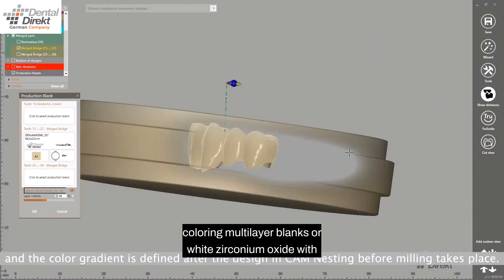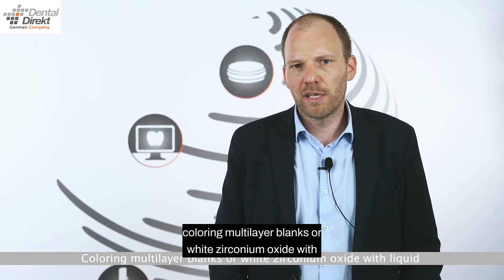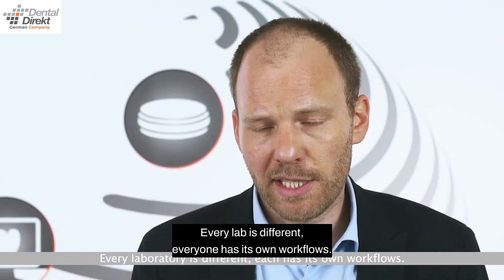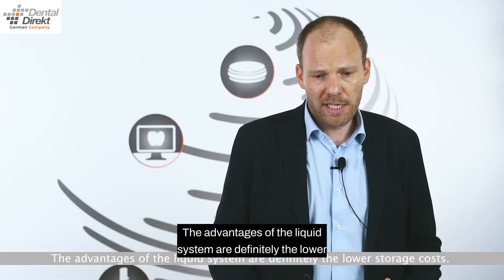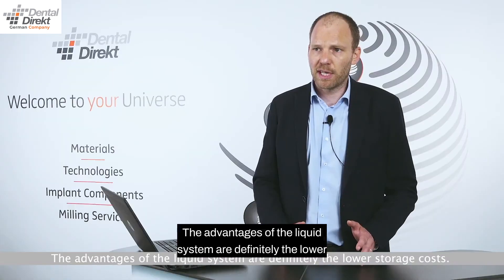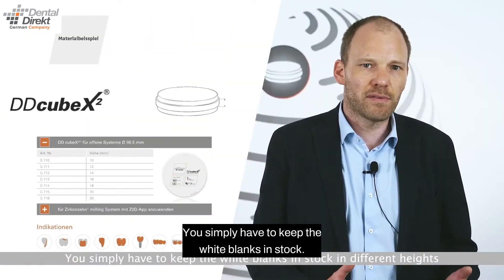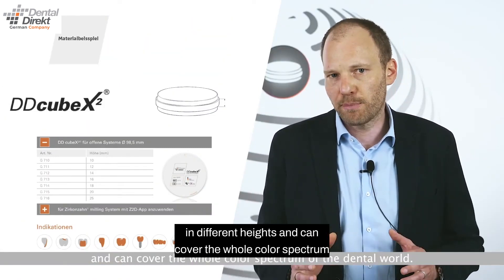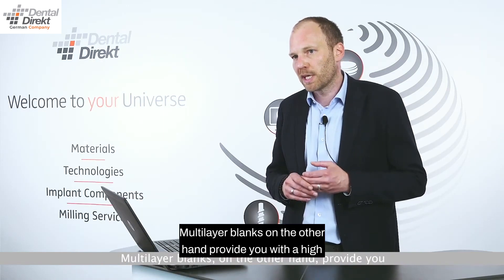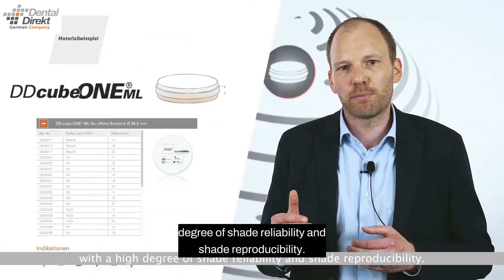Coloring multilayer blanks or white zirconium oxide with liquid is a question we cannot answer in general — every lab is different and everyone has their own workflows. The advantages of the liquid system are definitely the lower storage costs; you simply keep white blanks in stock in different heights and can cover the whole color spectrum of the dental world. Multilayer blanks, on the other hand, provide a high degree of shade reliability and shade reproducibility.